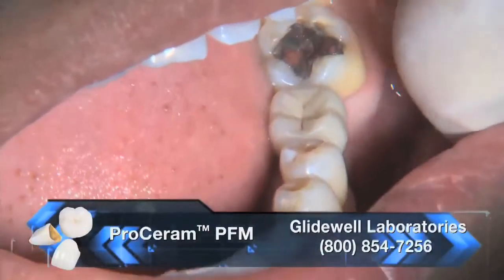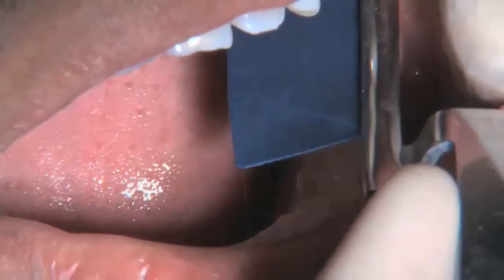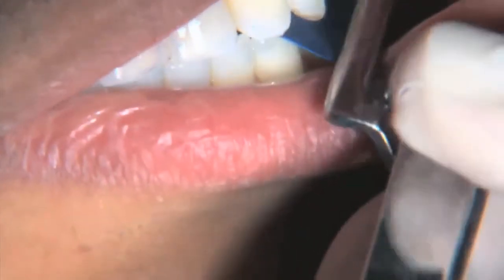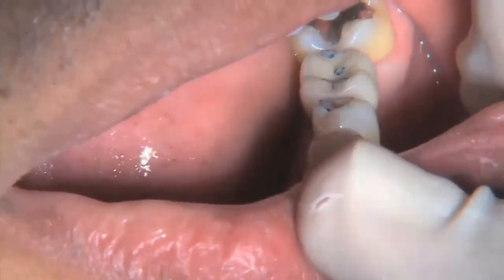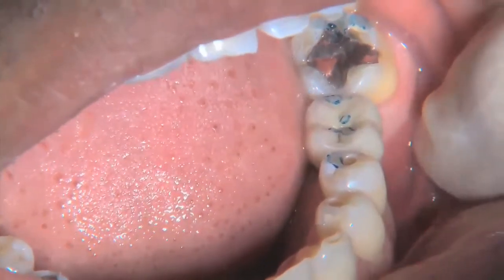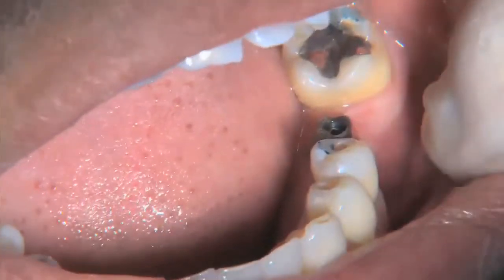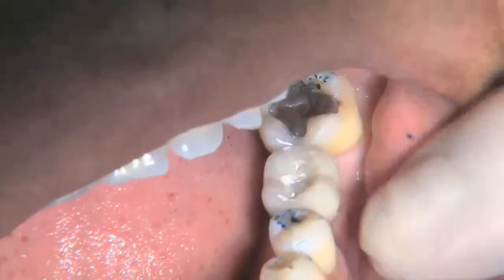We wish to have the implant-supported prosthesis slightly out of occlusion from the natural teeth, because as shown by Dr. Carl Misch and many others, natural teeth will depress anywhere from 50 to 75 microns. If this is the case, when the natural teeth depress under chewing forces, then that would make the implant-supported prosthesis supraocclusal, which will lead to traumatic occlusion and possibly vertical bone loss.